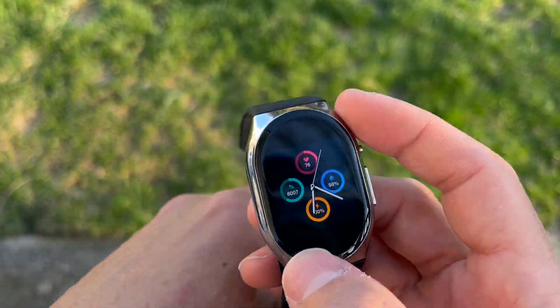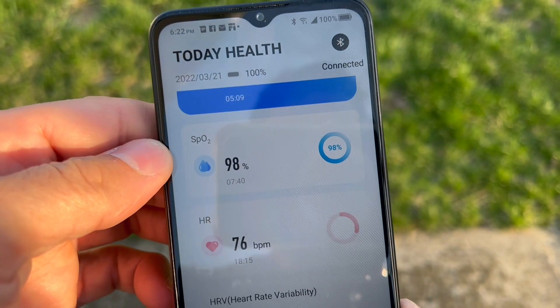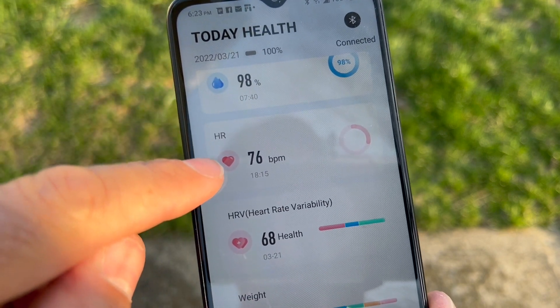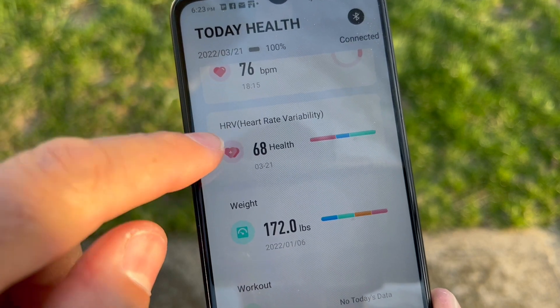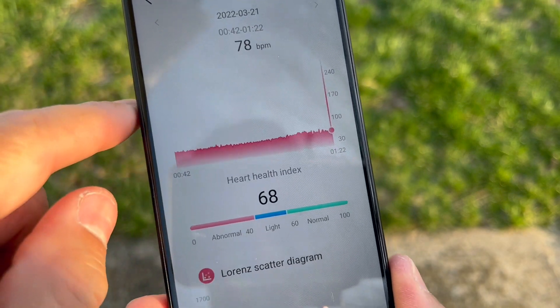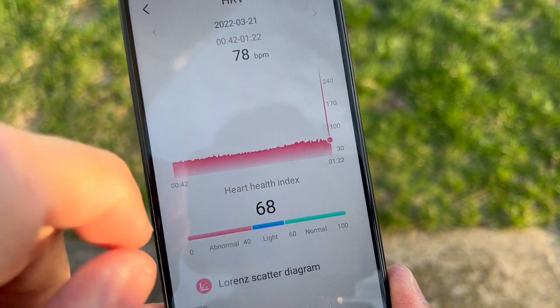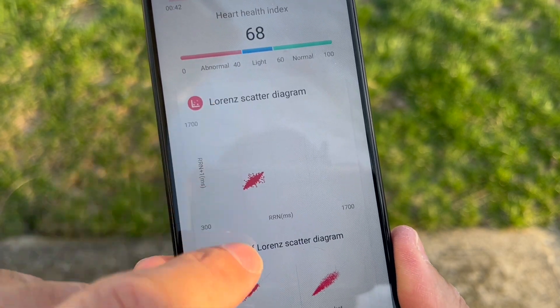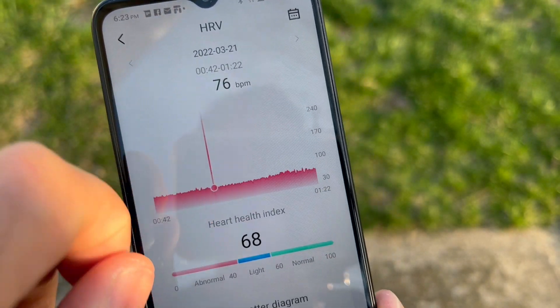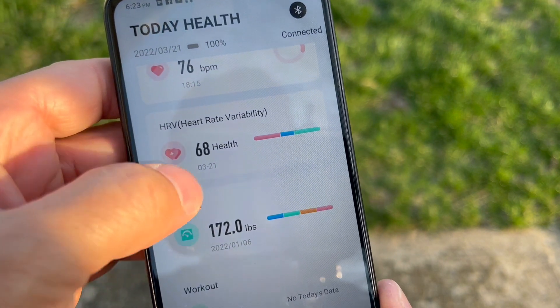Here is the BP Doctor app — this is where you get all your information. At the top is blood oxygen, underneath is heart rate at 76 beats per minute, then HRV — heart rate variability — which shows a Lorenz scatter diagram of your heart health index. I just started using mine so the data is limited, but I'm within the normal 60 to 100 range.